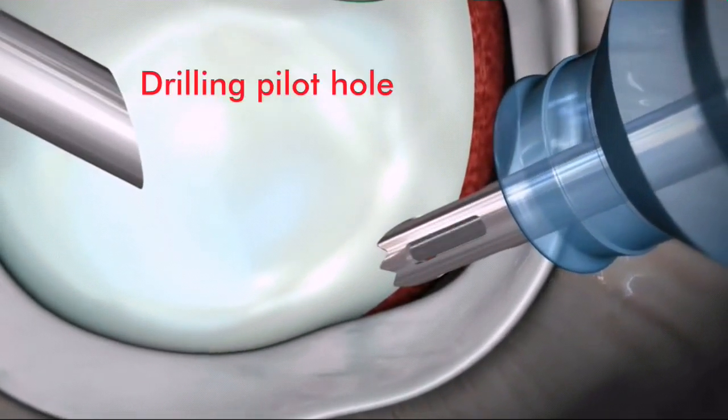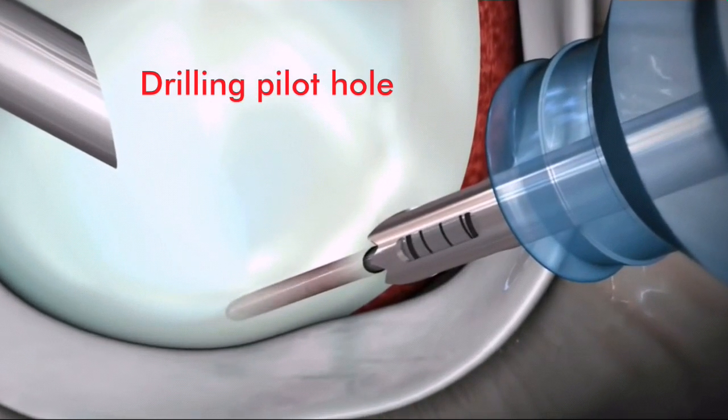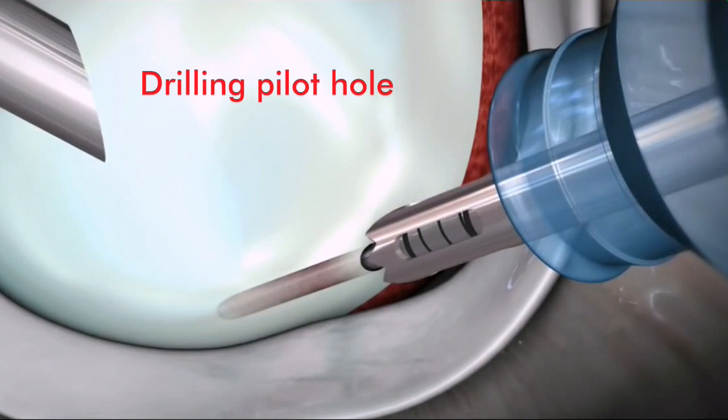Drill a pilot hole with the Y-knot drill, stopping when the laser markings on the drill bit fill the distal window in the drill guide.